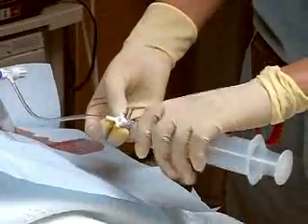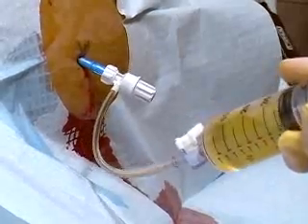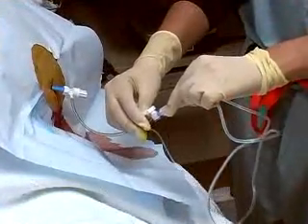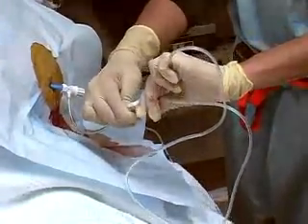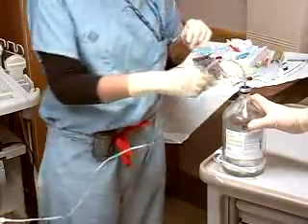Attach a large syringe to the paracentesis catheter and withdraw 30 to 60 milliliters of fluid for diagnostic analysis. Once fluid collection is complete, detach the syringe. If additional fluid needs to be removed for therapeutic purposes, attach high-pressure drainage tubing to the catheter and then insert the other end of the tubing into an evacuated container.